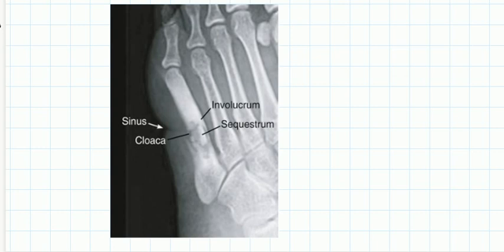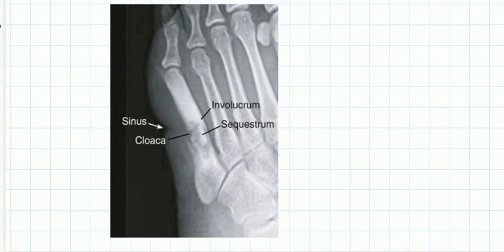Here is another example image. This is the fifth metatarsal of a little toe which has got infection. The white piece you see is what you call a sequestrum. Once you identify the sequestrum, look all around — there is increased density everywhere around this cavity.